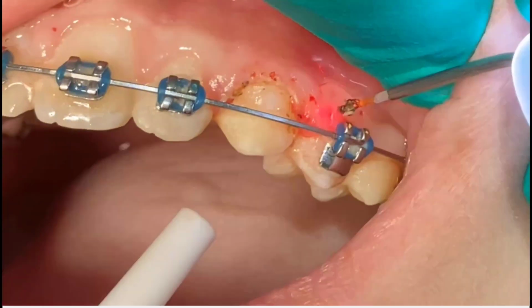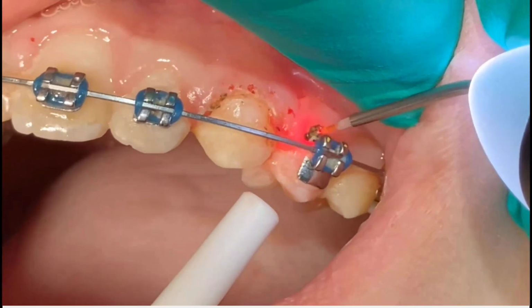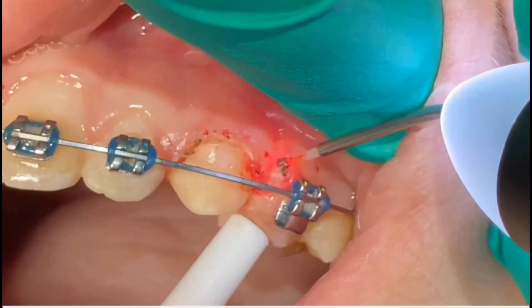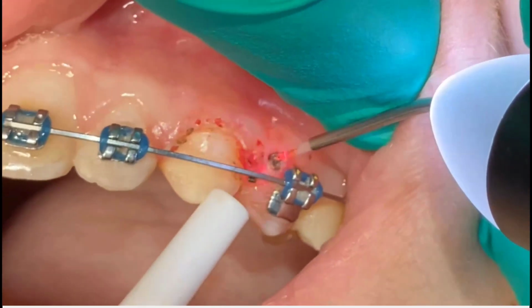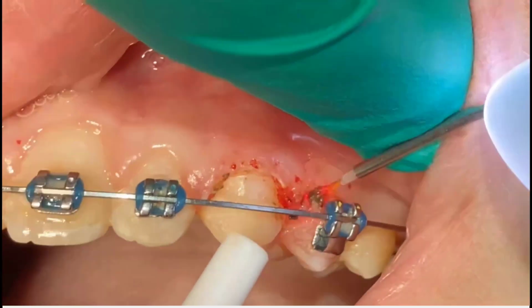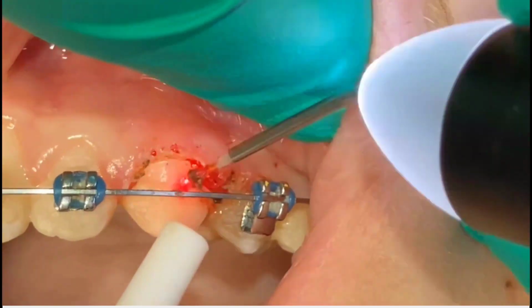Now, I'm going to do a bit more here by the bicuspid. In between the centrals, I have a little bit of inflammation. I'm going to do a little gingivoplasty between the centrals when I get there. Here, I'm reducing a little more tissue by the bicuspid, but I don't want to destroy the entire papilla. I just want to clean things up. Also remember that diodes will exert an antibacterial effect when they cut. So it's also going to reduce inflammation because of the antibacterial cut.